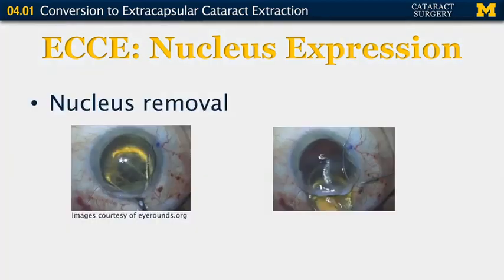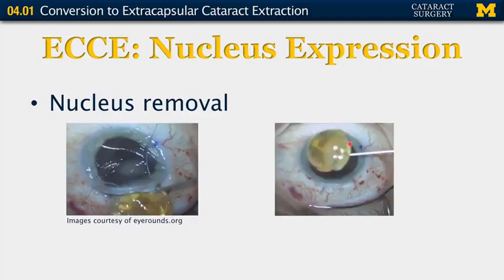Here are some pictures of nucleus removal. This surgeon placed safety sutures for quick closure if needed. The lens loop is placed inside the eye trying to get underneath the prolapsed superior portion of the lens. Additional pressure is placed on the posterior lip of the wound, and a muscle hook is rolled across the eye to add more pressure — the nucleus is basically rolled out of the eye and onto the lens loop. Here is what a nucleus looks like after it is expressed.